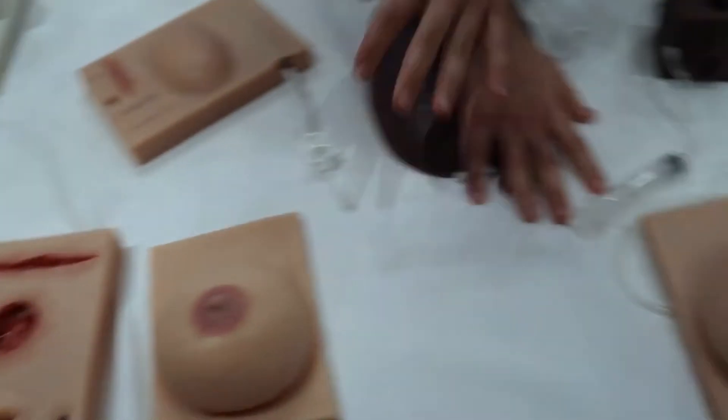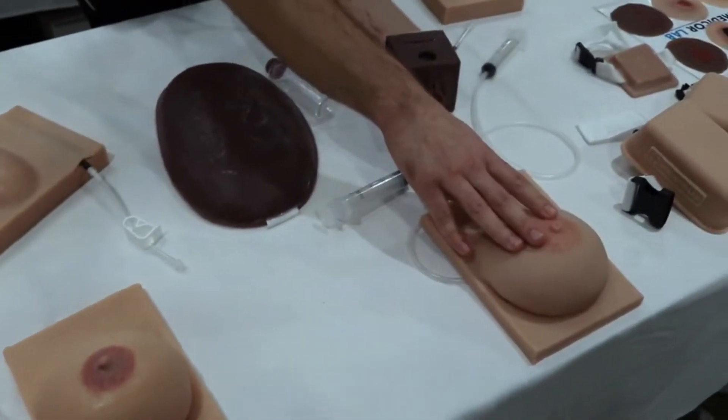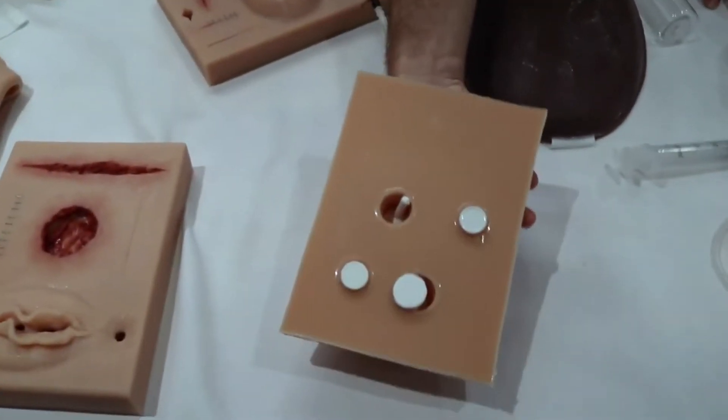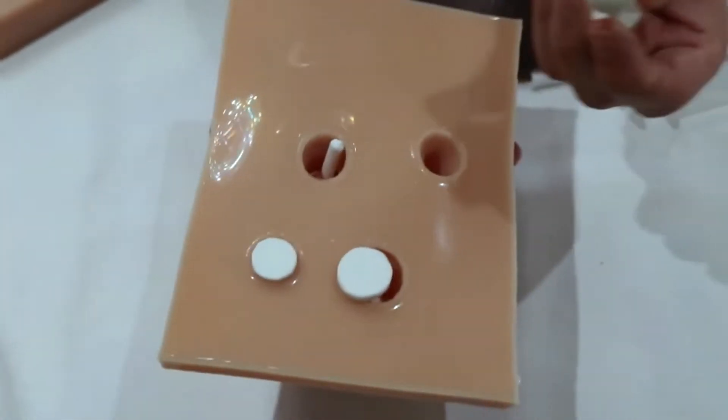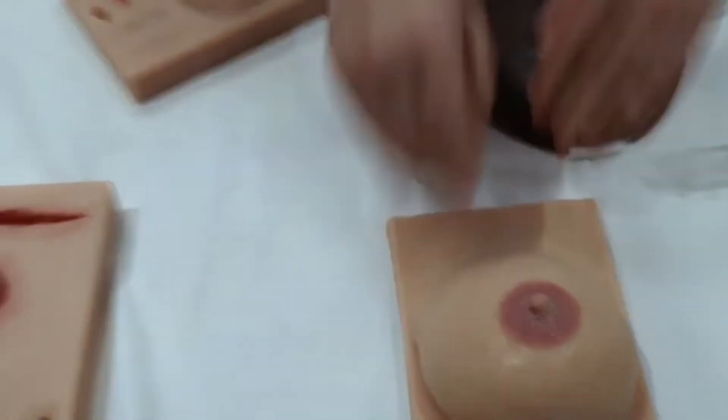We have breasts in different sizes — lactating ones with cracked nipples, inverted nipples, whatever you want, we've got it. Here we also have breasts with masses so you can provide different scenarios to your students, allowing them to assess where the mass is.